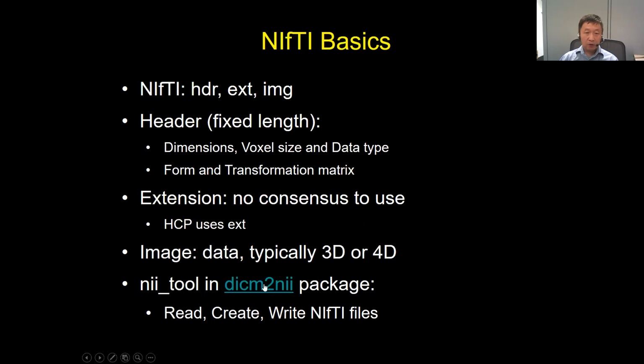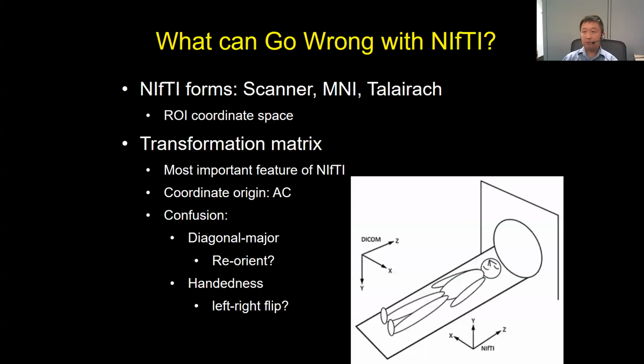The NIfTI tool in my package, the Dicom to NIfTI package, can read, create, and write NIfTI files in Matlab. We will go over that later. It's pretty convenient.